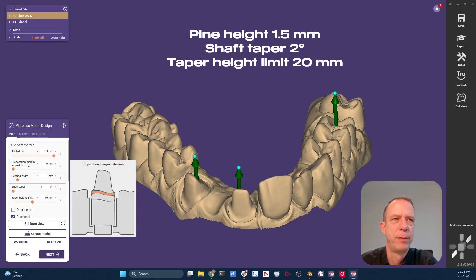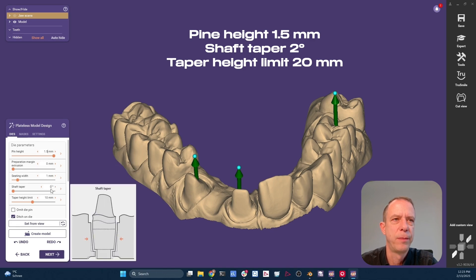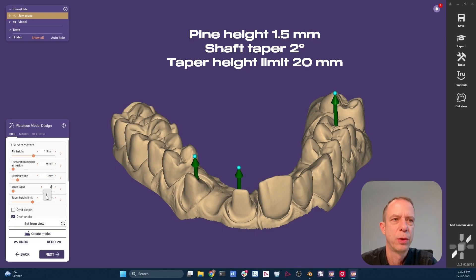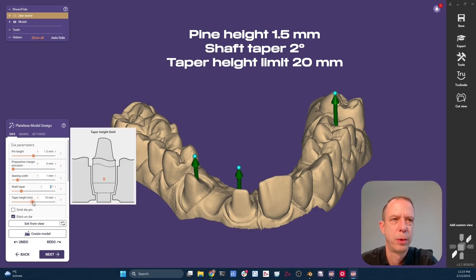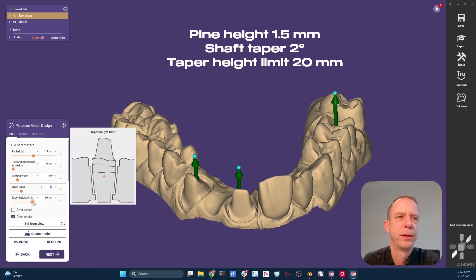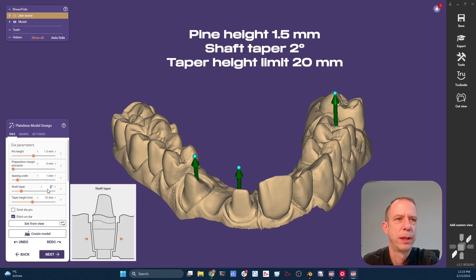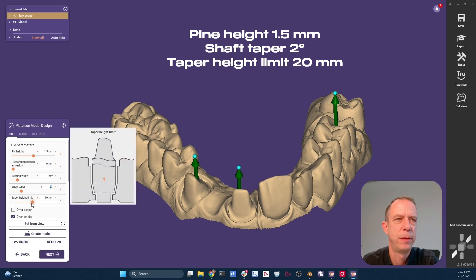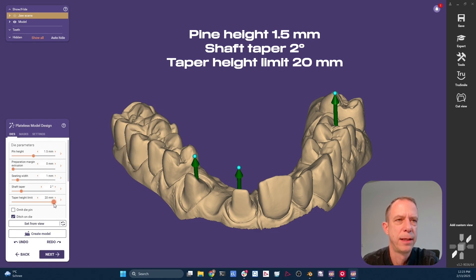Preparation margin extrusion, I also want it at zero. What we also covered in the last episode is that we want to have a taper. And for some reason, this is not automatic in the presets. So I'm putting it manually here, two degrees of a taper. I want to have the taper going the full length of the die. So I put this up to the maximum.